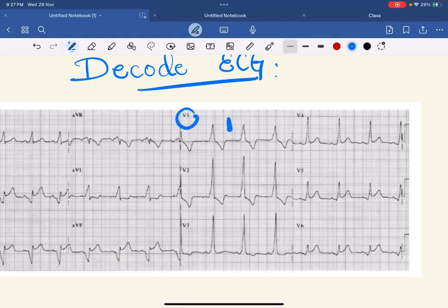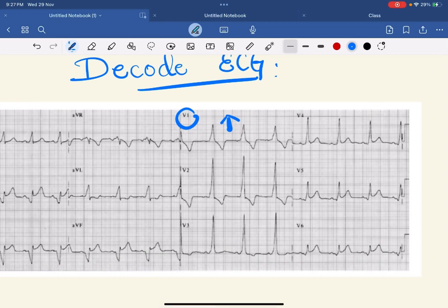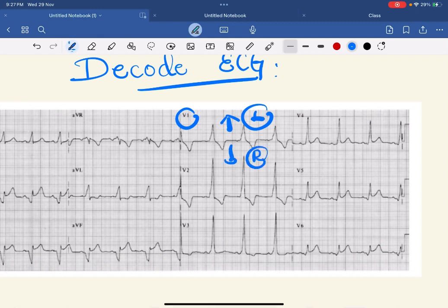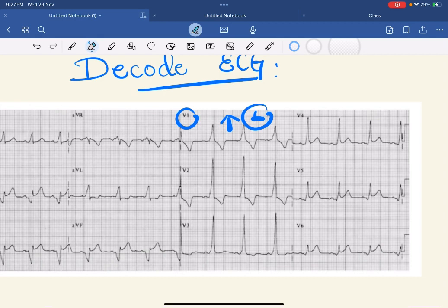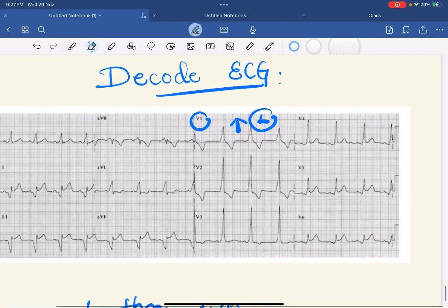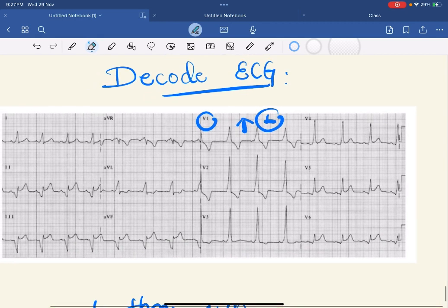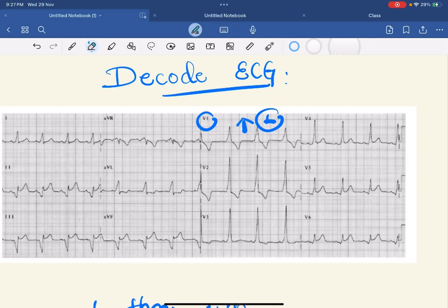In this ECG, the lead V1 shows predominantly upward QRS, so it is on the left side. Upside means left side. If it would have been down or negative, it would have been on the right side. When you diagnose it as left-sided bypass tract, you have to know whether it is posterior septal or anterior septal.